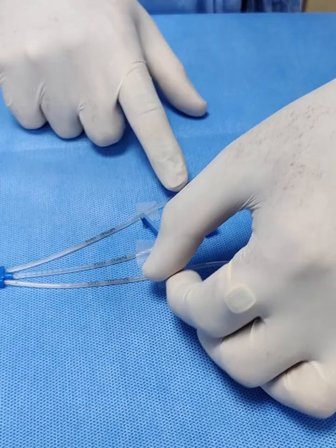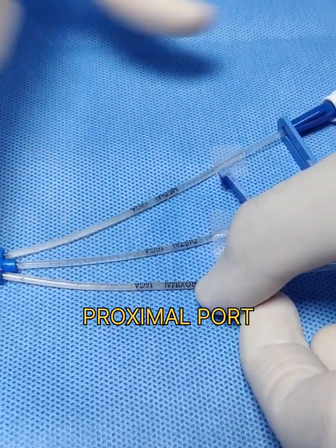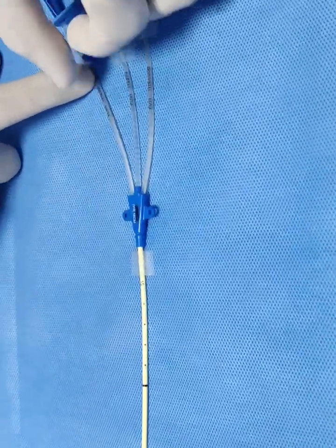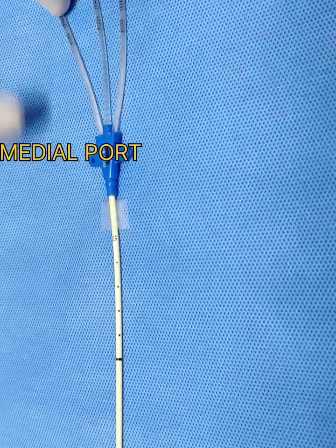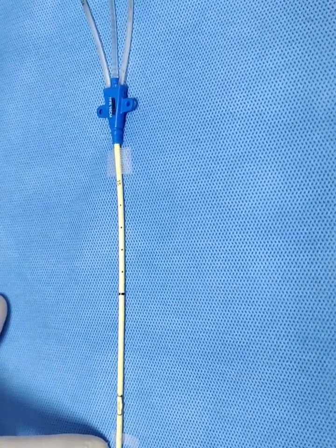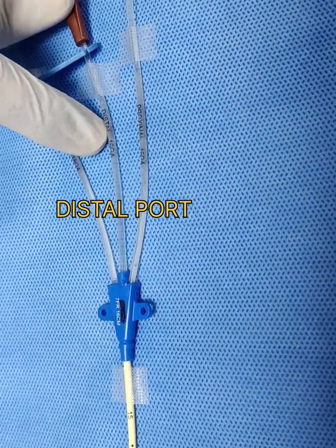There are three ports. The first is the proximal port, which is 18 gauge, and it opens at the proximal end where my finger is pointing. The medial port is also 18 gauge and opens at the medial point, distal to the proximal port. The distal port is a larger 16 gauge port.